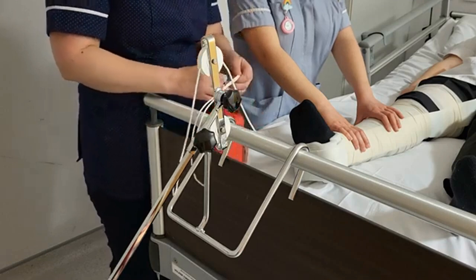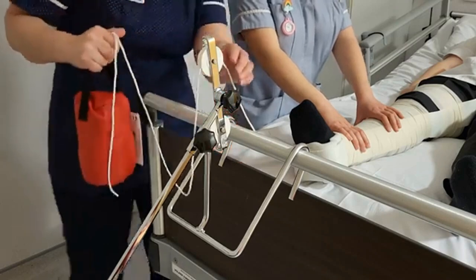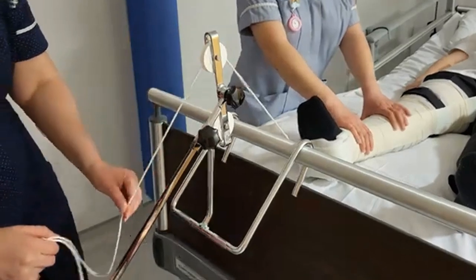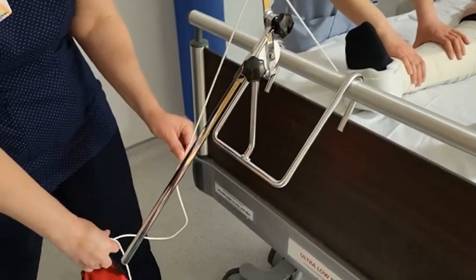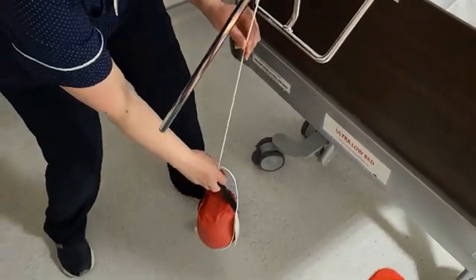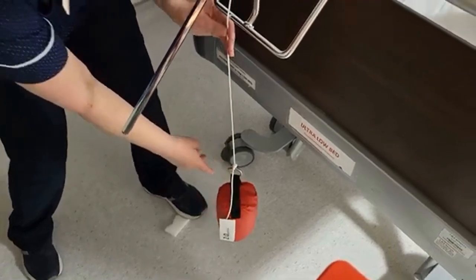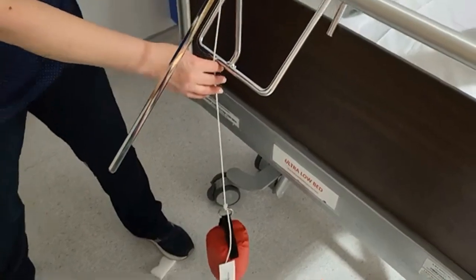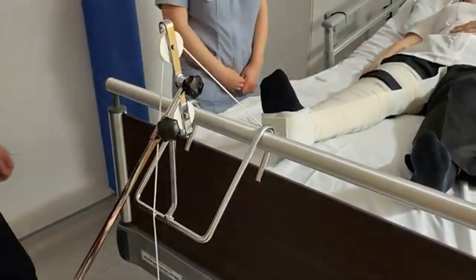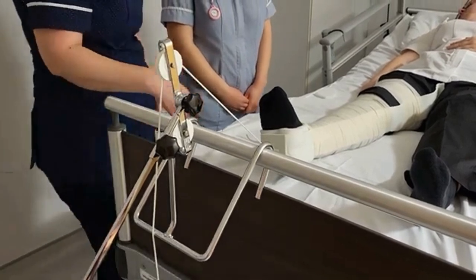Attach the weight, which has been prescribed by the doctor, usually around 10% of the child's body weight. Put your thread through the pulley and then very carefully lower the weight — the weight must not be touching the edge of the bed and must not be on the floor; you want the weight free from the floor. Very carefully let the weight go and then the person holding the leg can gently and carefully remove their hands. That should be nice and comfortable for the patient. We're now in traction.